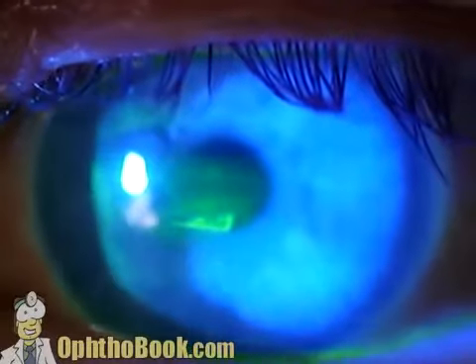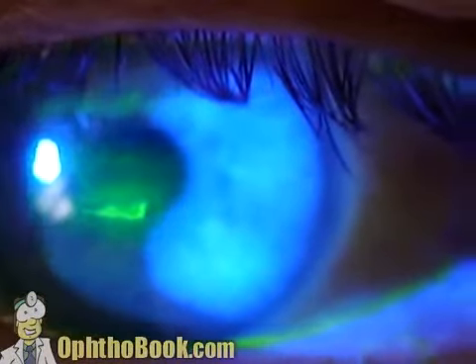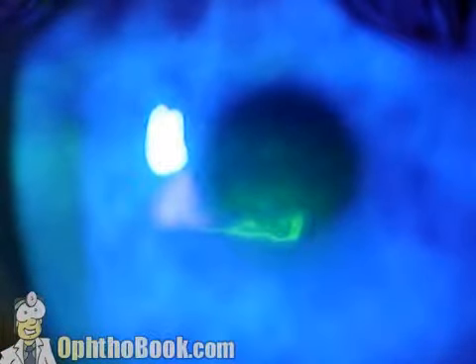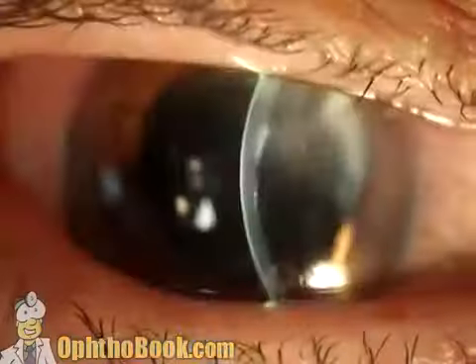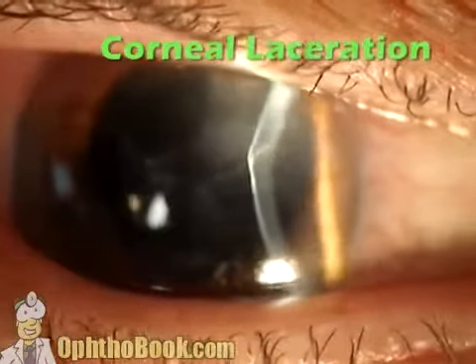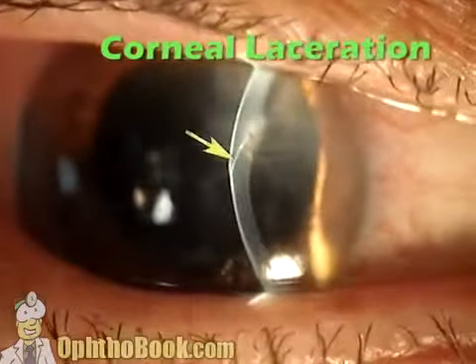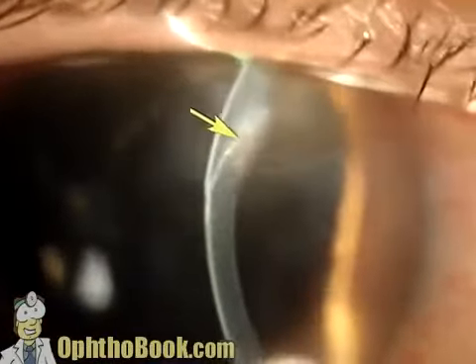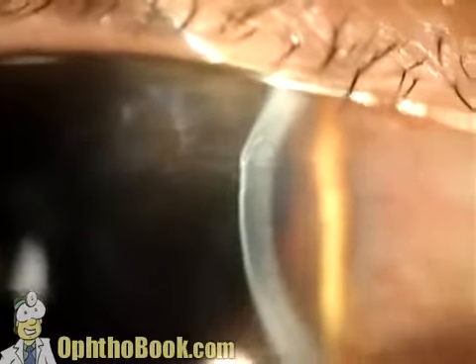I'll give you a better example here. Scratch on the surface of the eye, and that fluorescein sticks to that area and is very easy to see with the blue filter. It's also useful for finding leaks. This is a patient who has a corneal laceration, a nail through the eye, and we know it's a laceration because if you look at that, you can see a line going from the front of the cornea to the back. The question is, is it leaking or not? It's hard to tell just looking at it.